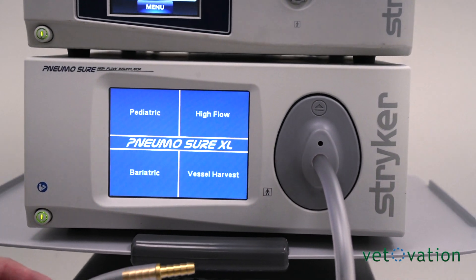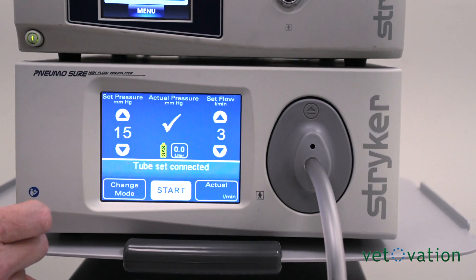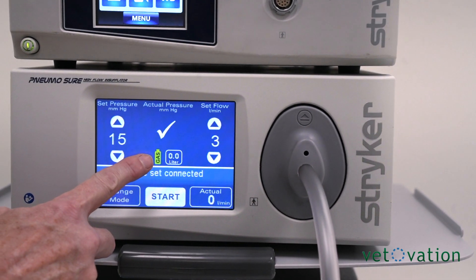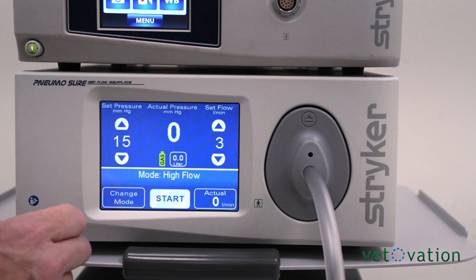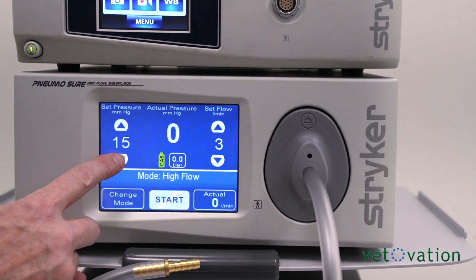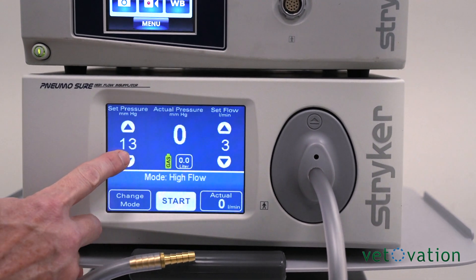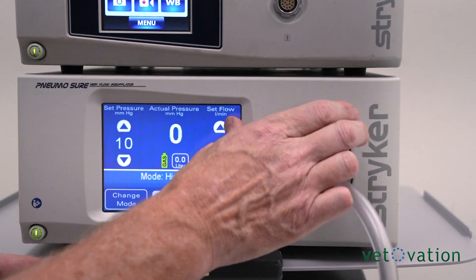The CO2 insufflator goes through a self-test. You're going to want to select high flow and check to make sure that your gas is full. If this gas was showing red, it would mean your bottle is empty and you would not start a case. Adjust your internal abdominal pressure down to 10 and turn your flow up to 10.